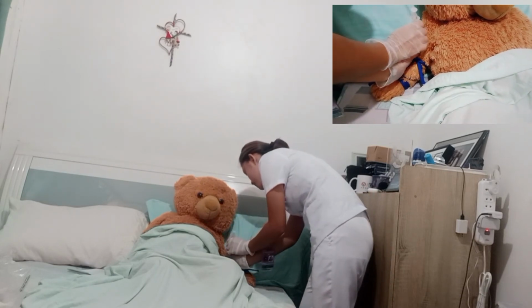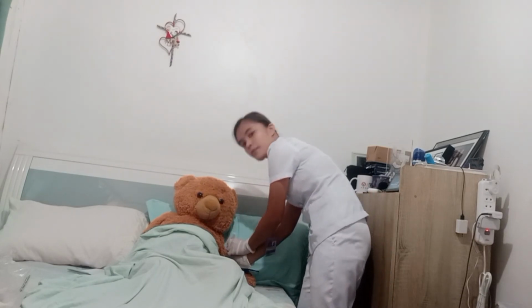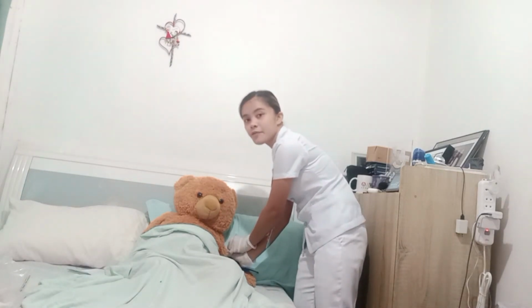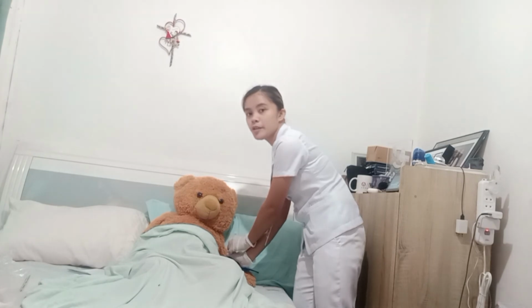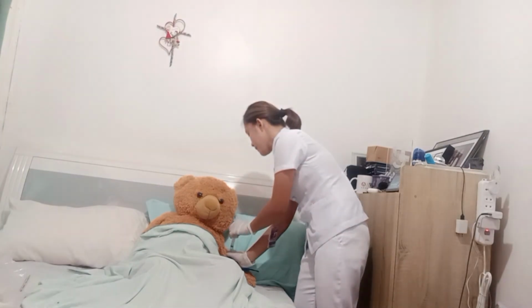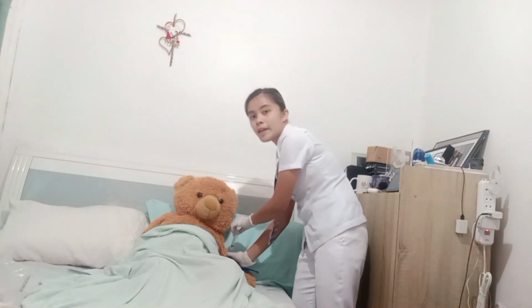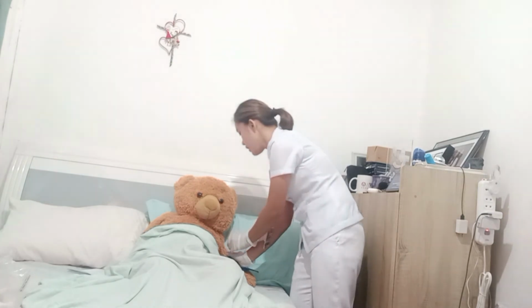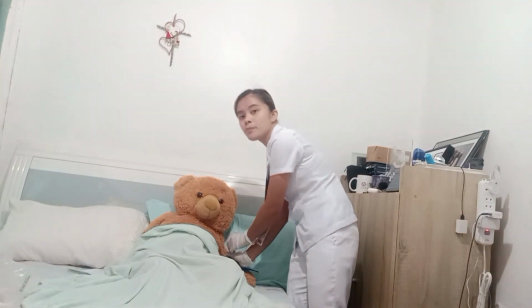Now aspirate the syringe by pulling back the plunger with the dominant hand, and if blood appears, then you are not in the muscle. So remove and discard the needle and the syringe and start over. If there is no blood, then you may proceed.